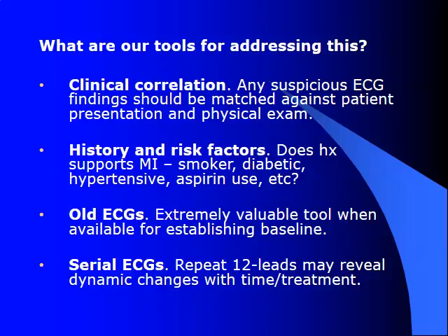Well, as the nitro wears off, that clot becomes patent again, and prevents blood flow to the myocardium. So this patient had ST elevation, and they gave him nitro and took their 12 lead afterwards, and the ST elevation had resolved. By the time they get to the hospital, the ST elevation's back because the nitro's worn off, and the hospital is saying, "What you got? Why didn't you guys call a STEMI alert?" So, I mean, that's happened a few times, so it's something to think about whenever you're giving your nitro. Try and get that 12 lead EKG before you give it.